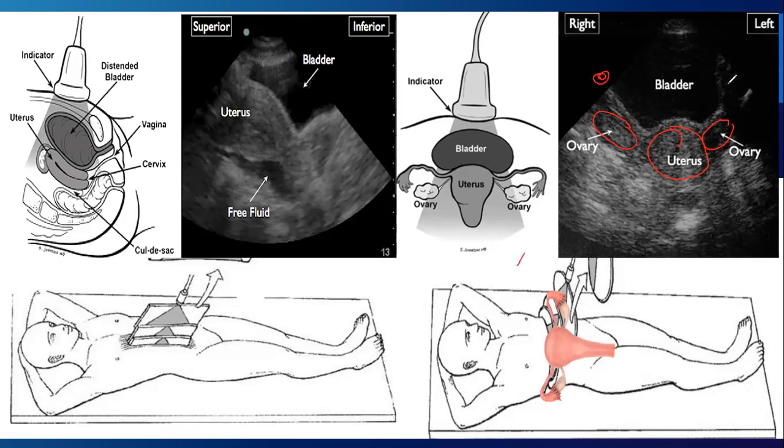This is the right, this is the left. This is towards cephalic, towards the patient's head. This is towards the patient's feet, okay? And this is anterior and posterior, okay? So this is the TS.